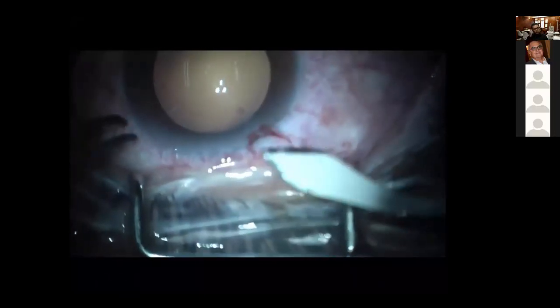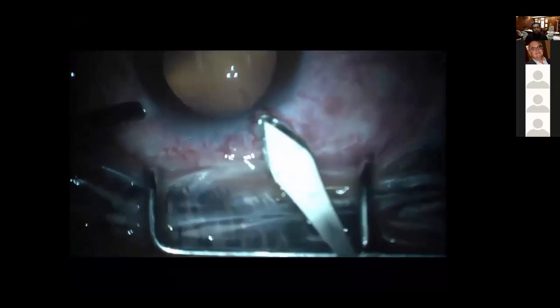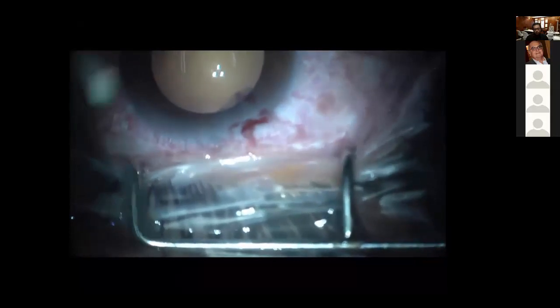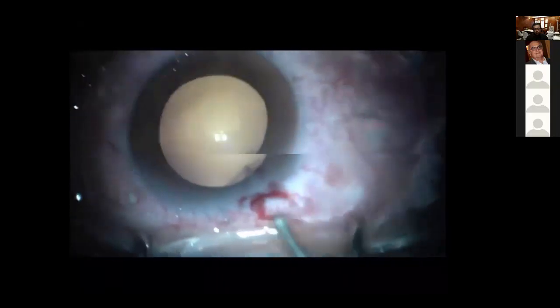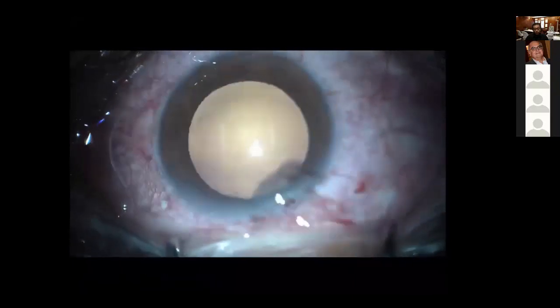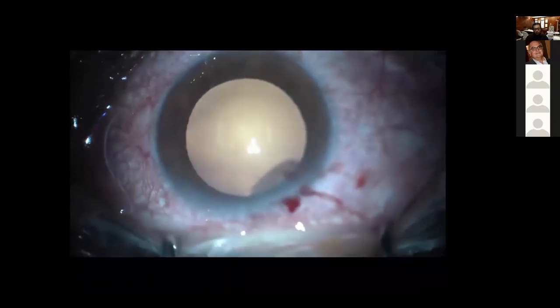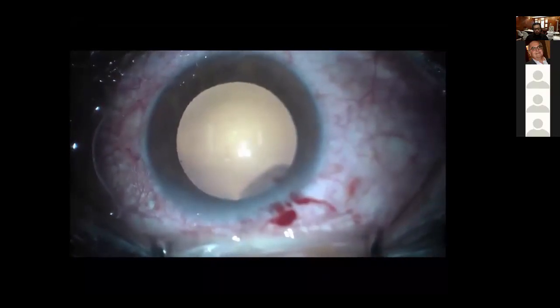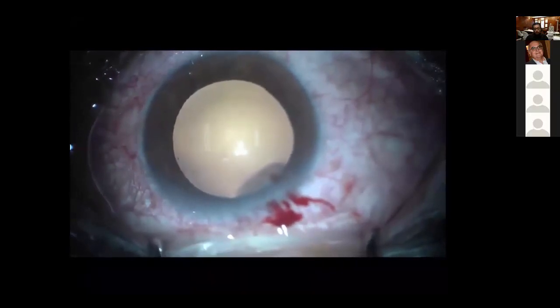And the depth of the anterior chamber? The depth of the chamber, fortunately, was good. It was around 3.2 millimeters in depth, which was convenient enough for us to perform such a surgery. And do you remember the axial length? I think it was 19, as far as I remember. Wow. The question that should be raised here: should we implant one intraocular lens in the bag and the other one in the sulcus, or put the two lenses inside the bag?